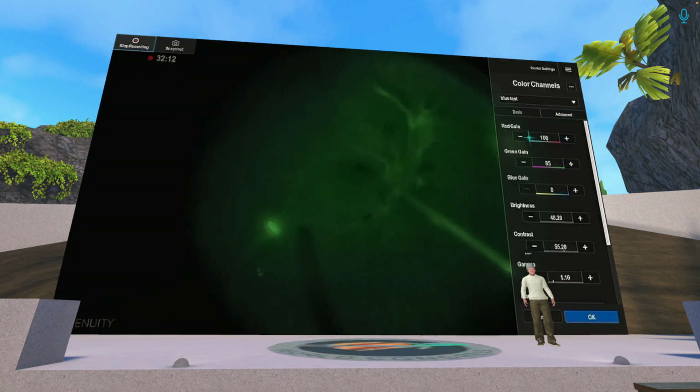It's a little bit of a catch-22: one thing that Alcon wants to see before they put more money into this is more people using it and saying that it looks good, but without some science behind it, it's a little more tricky to optimize.